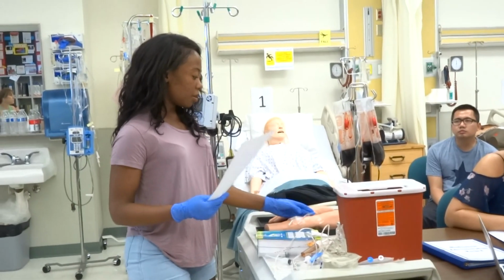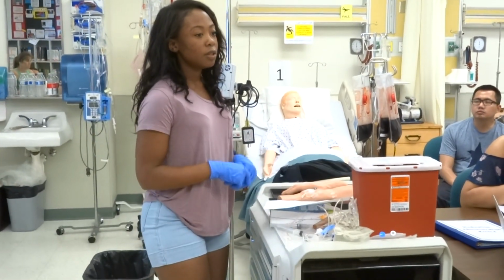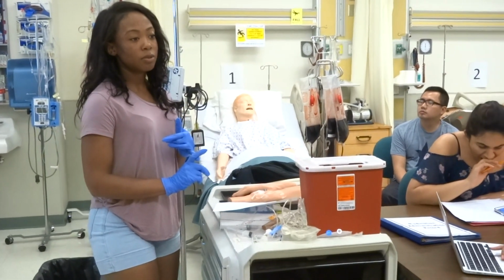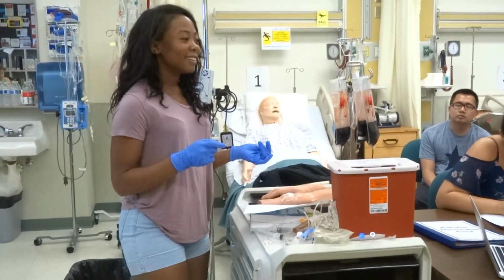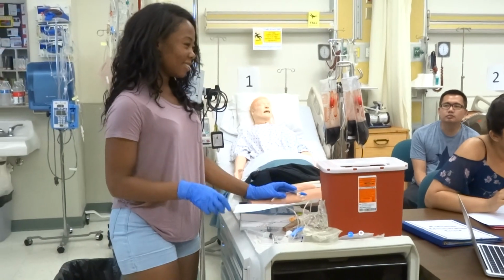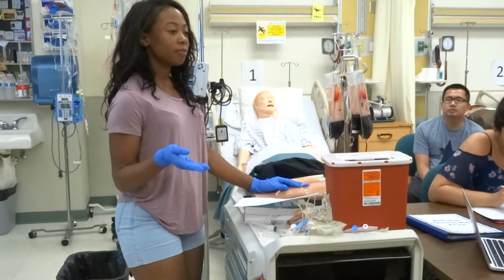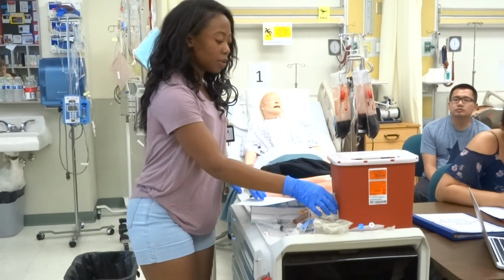I did my assessment on my patient. I've determined that they have fluid in their lungs because they have pneumonia. What I'm going to do next, I've already checked that they have no allergies to this medication that they're getting. And then I'm going to... Sorry, I'm silly. I checked their labs. Okay. So let's begin with setting everything up.